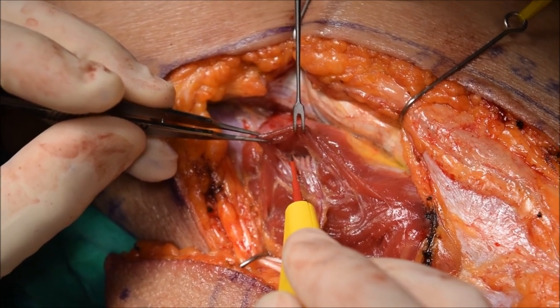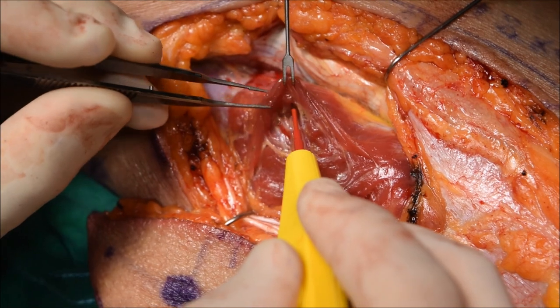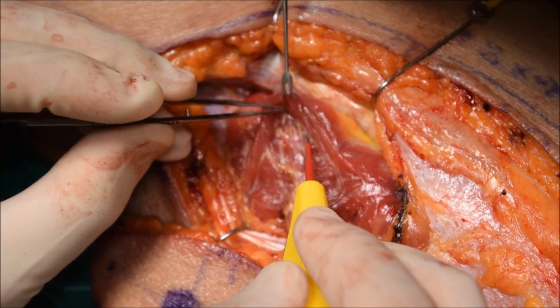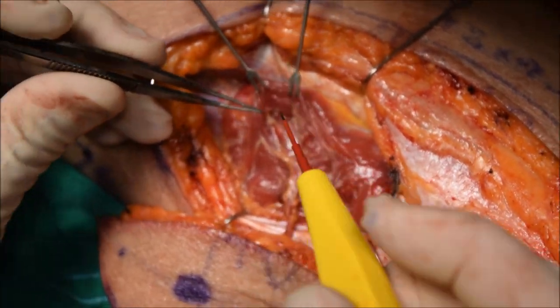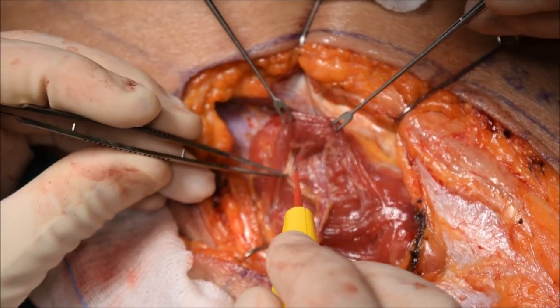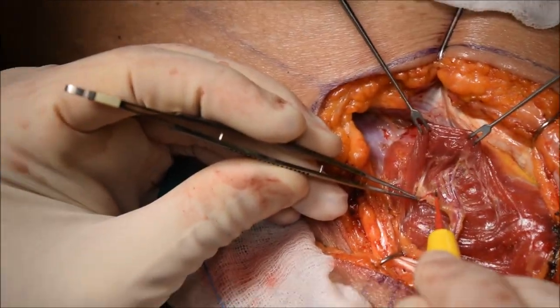Note the twitching of the muscle now as we enter the intramuscular portion of the perforator and dissect. Look how important the traction is — the traction makes the muscle twitch minimal. Even though it's twitching, because of the traction you could relatively have a very stable muscle and see that perivascular plane within the muscle surrounding the perforator, and be able to hit that target to dissect while also coagulating the branches coming out from this perforator, as you can see in the video.